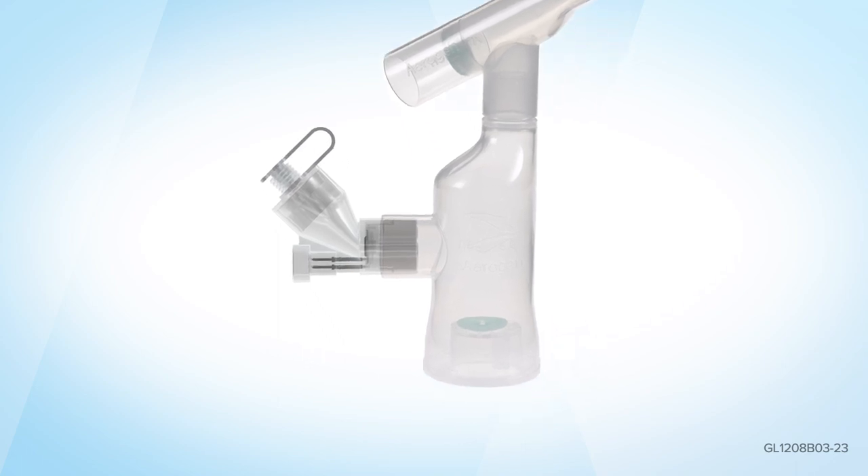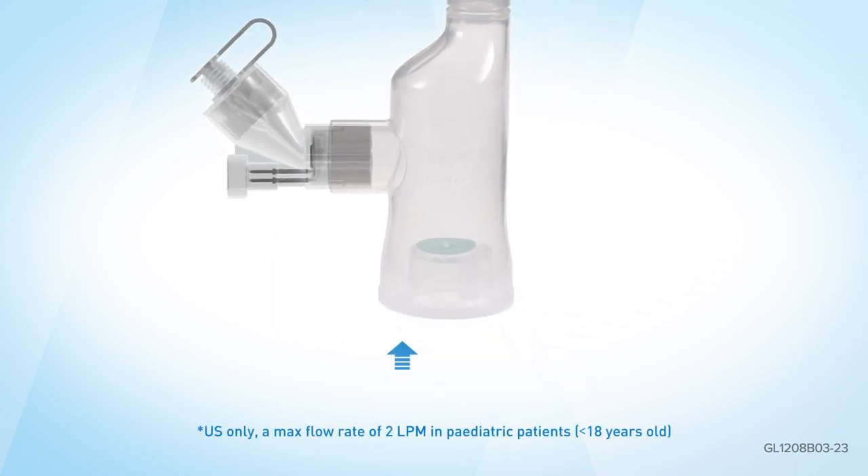If supplemental oxygen is required, firmly attach oxygen tubing to the Aerogen Ultra. The oxygen flow rate should be set between 1 and 6 litres per minute.